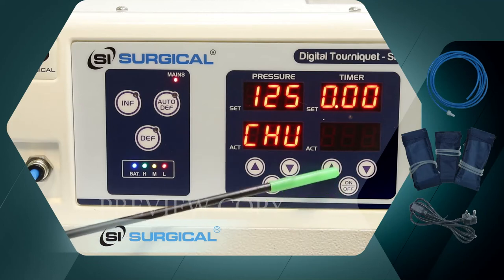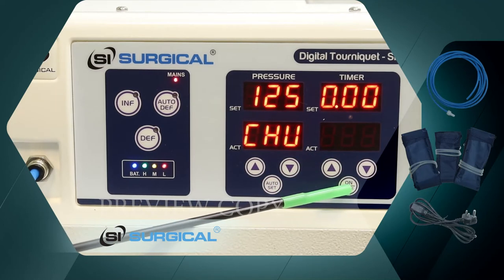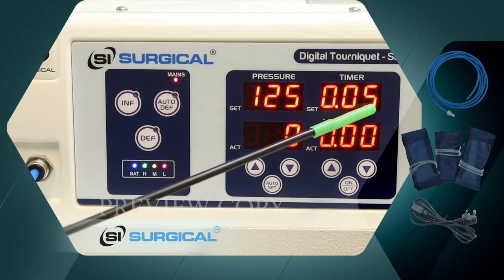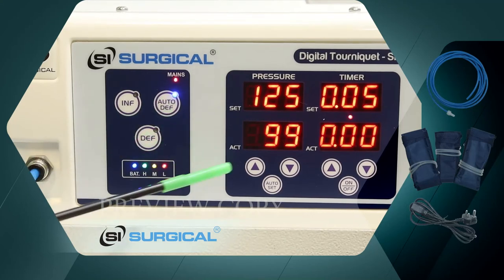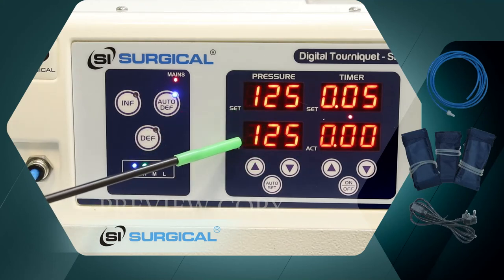This is the timer, which we set to 5 minutes. We push the auto deflate button and set it to 125. This is the actual cuff pressure.